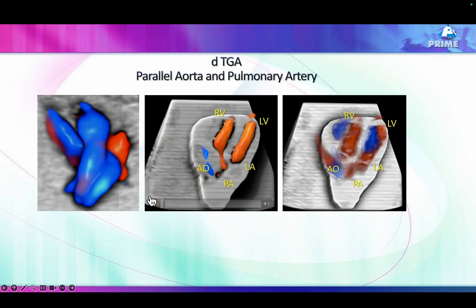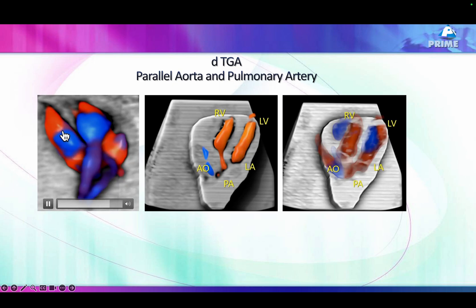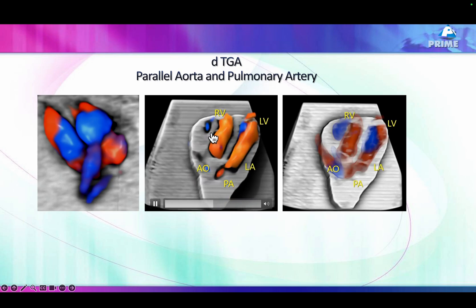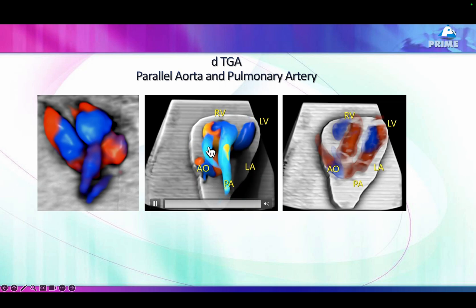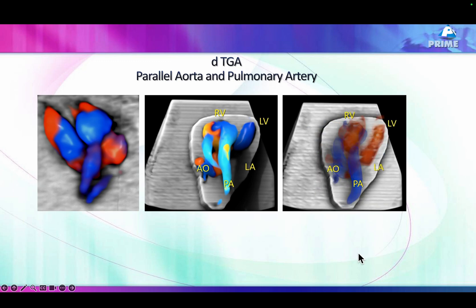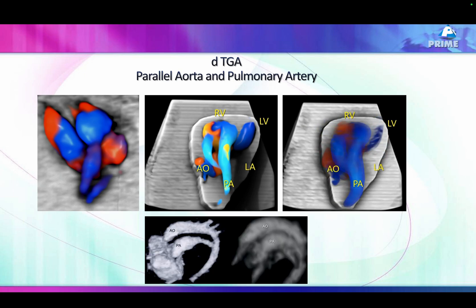The crossover rules out TGA — if there is a crossover, it's not TGA. But if both vessels are parallel to each other, this is an indirect sign of transposition of great arteries. As you can see here, there is a crossover: the aorta is going this way and the pulmonary artery crosses at 90 degrees — this is a patient with DORV. In the other case, the vessels are going parallel, and these two parallel vessels indicate transposition or malposition of the great arteries.